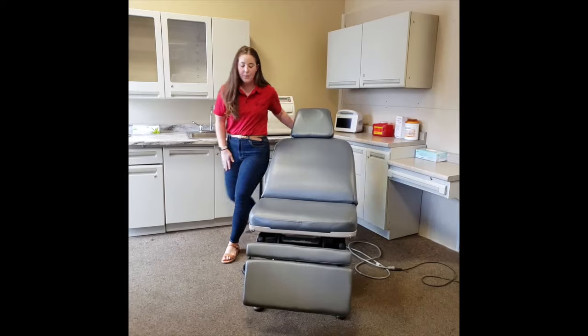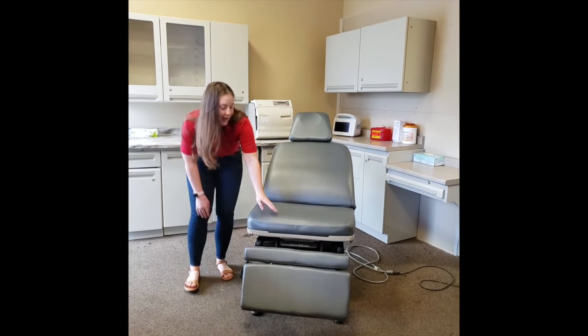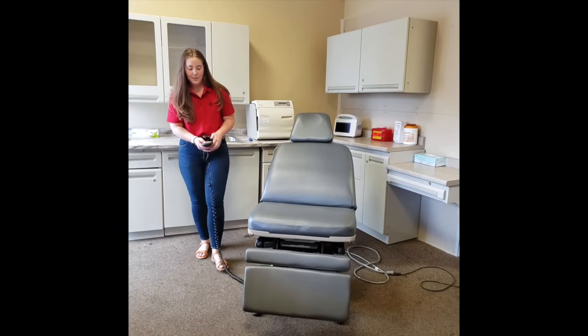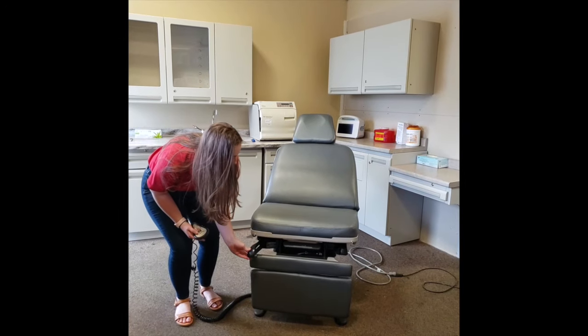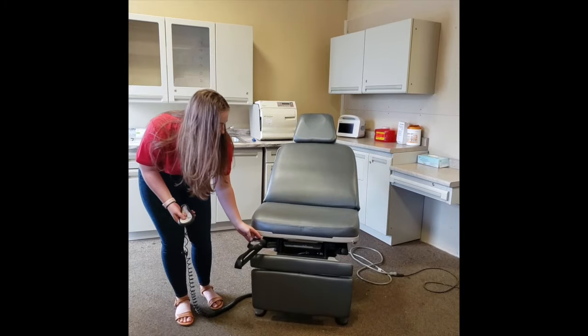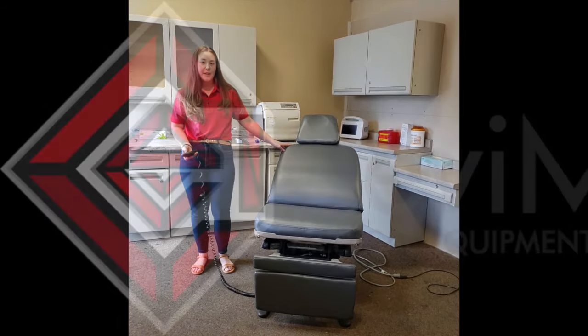Lastly, we have two stirrups that, if locked by the bottom panel, you bring all the way down. Now we can extend our stirrups and bring them forward. This is the Midmark 75L chair by Sevimed.